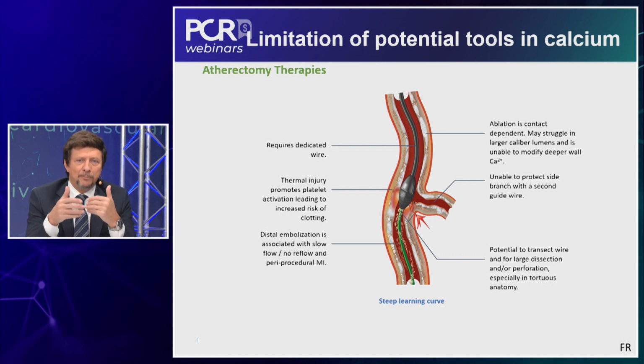Then what you ablate is embolized. Of course, these are microparticles, so normally not a problem, but in small vessels, long lesions, in patients with impaired LV function, so with microvascular dysfunction, these might create some low flow, ST elevation, and you are in trouble.